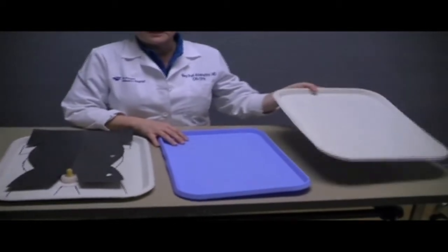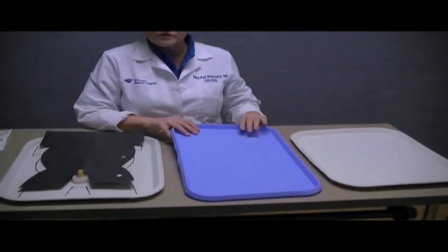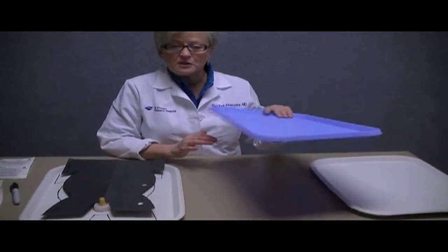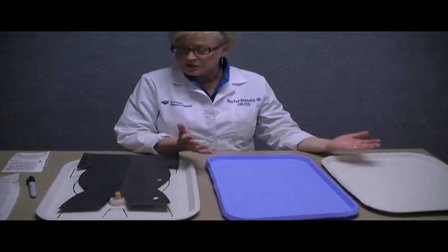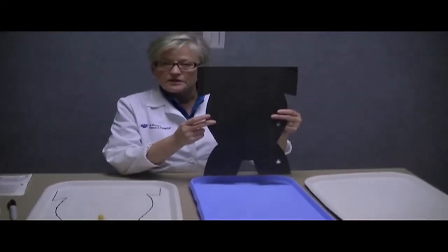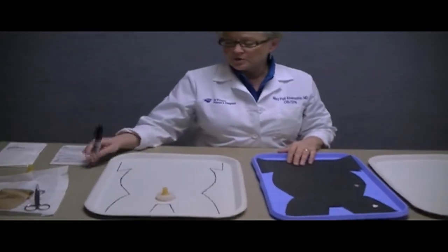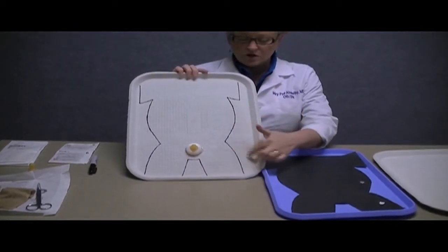We have these very inexpensive cardboard food trays, or we also figured out that with each vaginal delivery set, a very thin plastic tray. Once you have your tray, you could even use a cafeteria tray if you wanted to, but once you have it, create an outline, cut it out on cardboard so you can reuse it. You'll use some type of a permanent marker to then draw the outline on your tray.